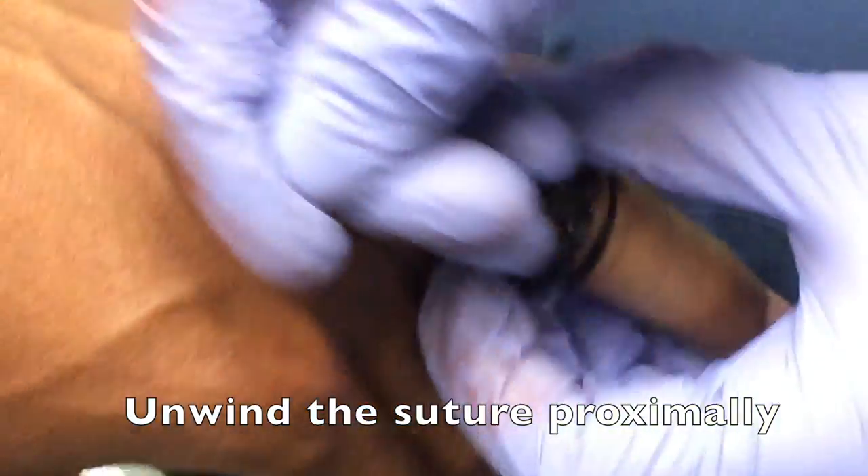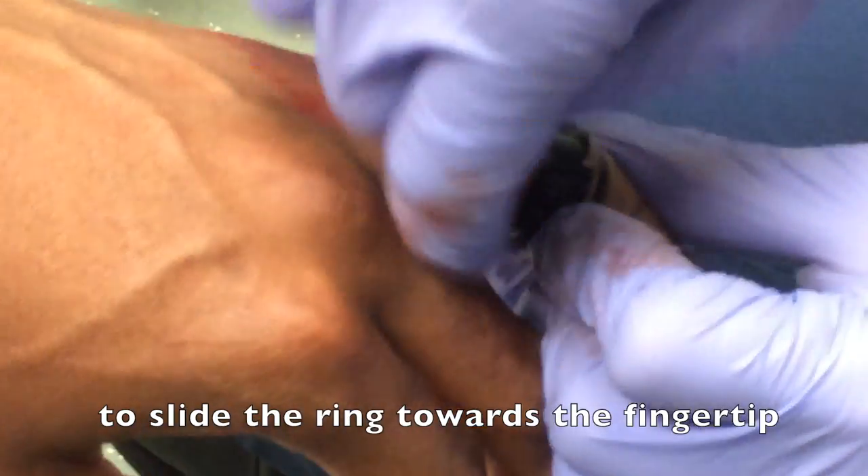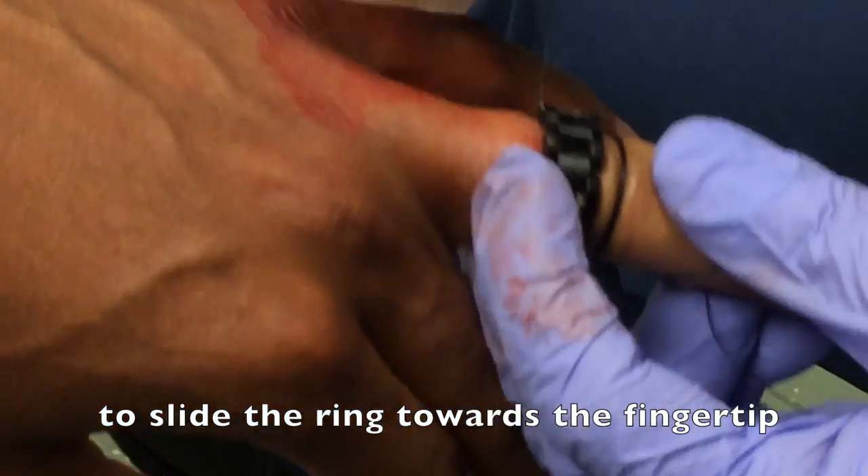After you've coiled it tightly, you're going to begin to unwind the suture proximally in order to slide the ring towards the fingertip.